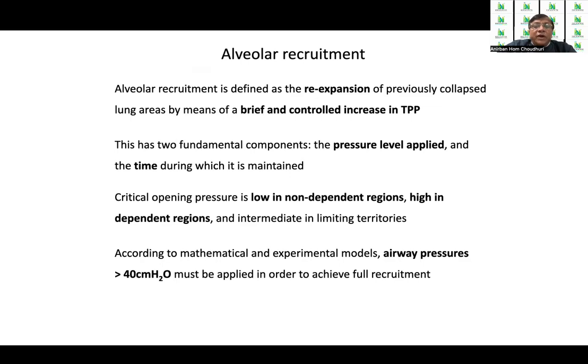So this has two fundamental components: one is the pressure that is applied, and the other is the time for which it is maintained. If the pressure applied is optimal but the time is less, then the recruitment will not be correct. If the pressure is less and the time is prolonged, then also the recruitment will not be complete. So both are important. Critical opening pressure is low in non-dependent regions and high in the dependent regions, and in between there is a territory where it is intermediate.